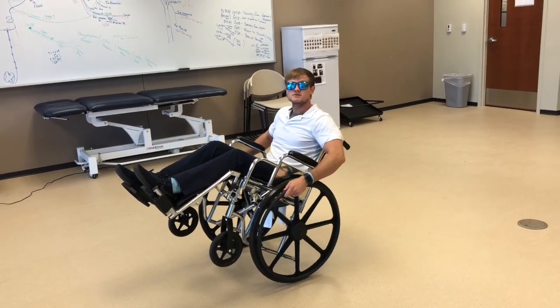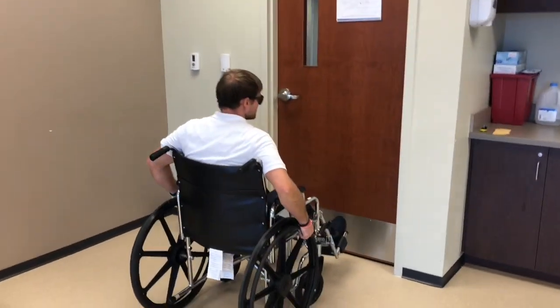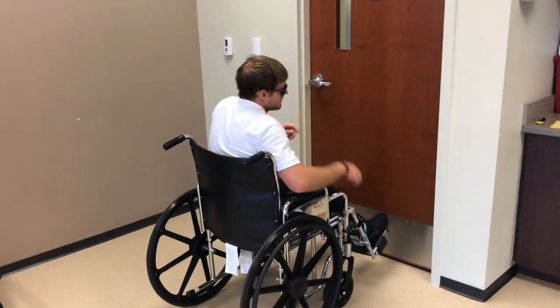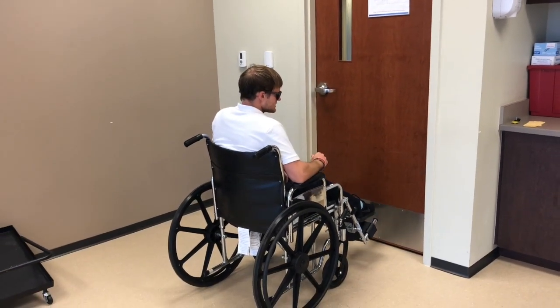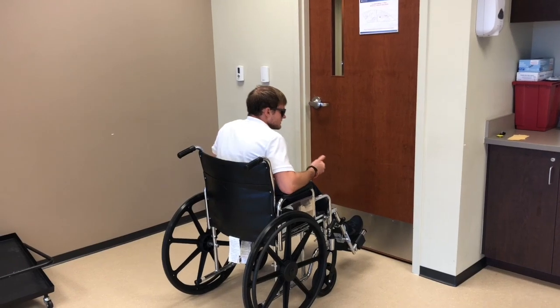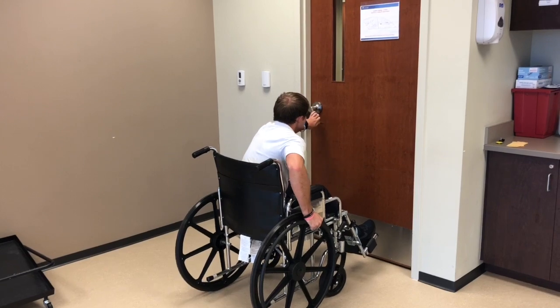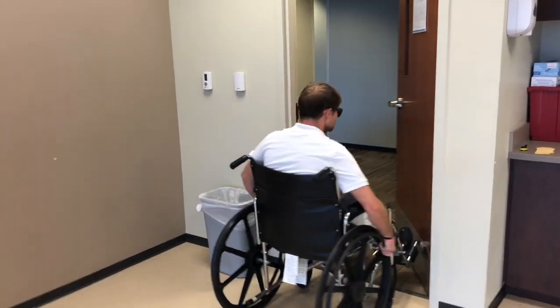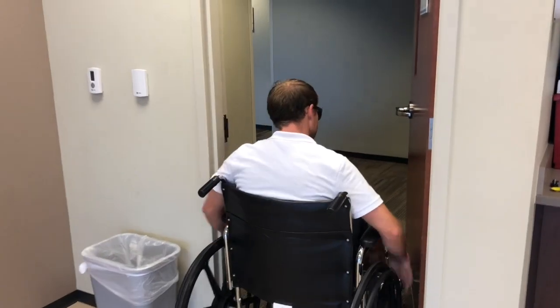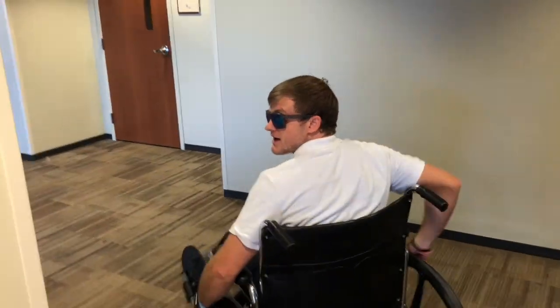Now I'm going to show you guys how to open a door with a wheelchair. I'm going to open this door and use the wheelchair plates to open it up. That's why they have metal in these doors for people with assistive devices — so they don't damage the door. I'm just going to open this door and use the wheelchair plates to help me get out.